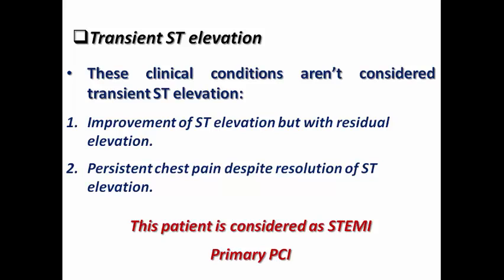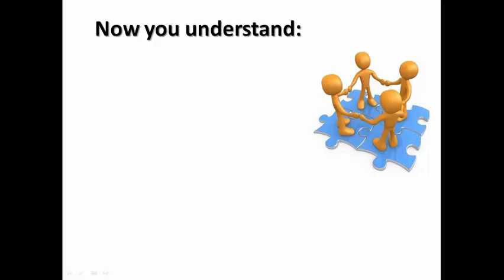So in order to consider it transient ST elevation, the patient should have complete resolution of ST segment and also disappearance of chest pain. And so this is not very common to see these two conditions, and so in most of the cases you are still going to deal with the patient as STEMI.